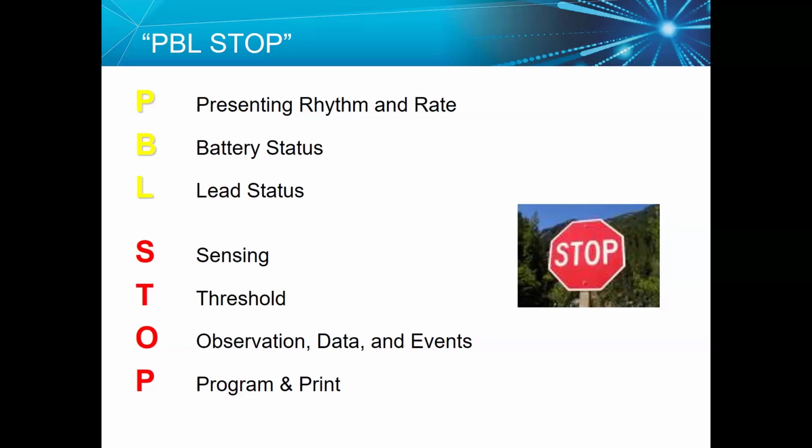This is the scheme for every patient who has a device, single-chamber ICD, single-chamber pacemaker, ICD or pacemaker or CRT-D. We will go through it in a systematic approach.